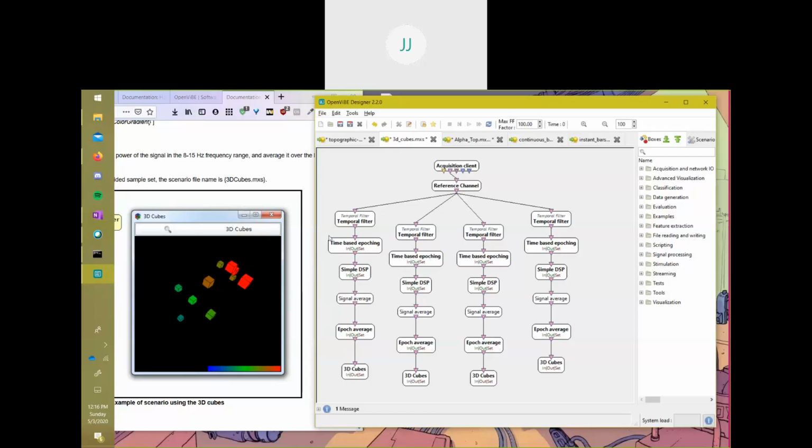When someone closes their eyes while hooked up to the EEG system, they relax and their alpha signals would be set off, specifically in the posterior section of the brain, and the electrodes at those areas would grow bigger.